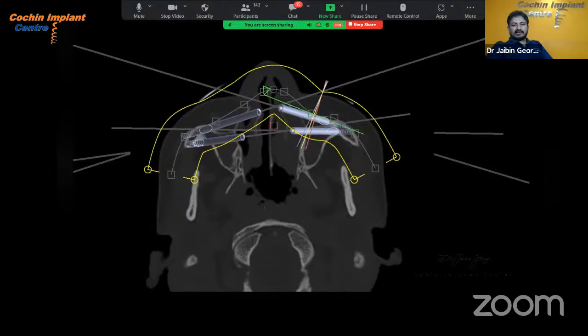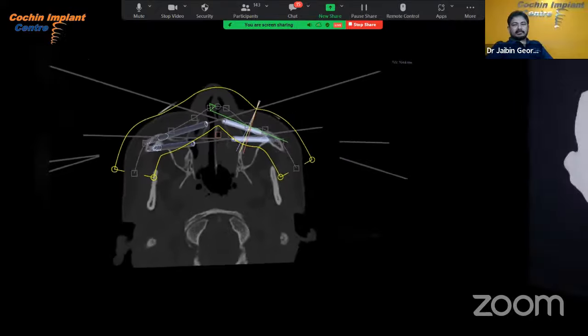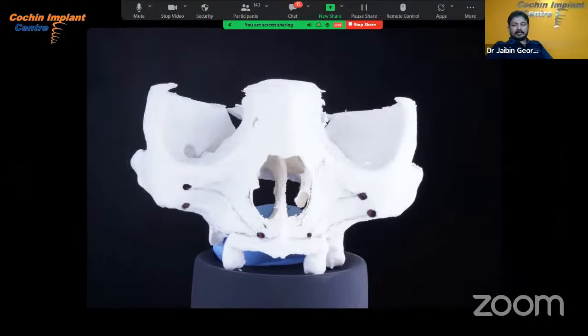So virtual planning is done and we printed a 3D model. And these are the markings which we made, the point of entry into the zygoma and our starting point. Usually we start at the 5 region, that is the second premolar region.